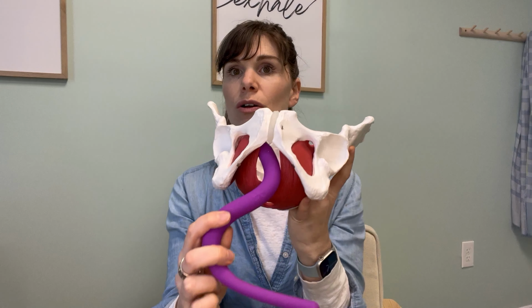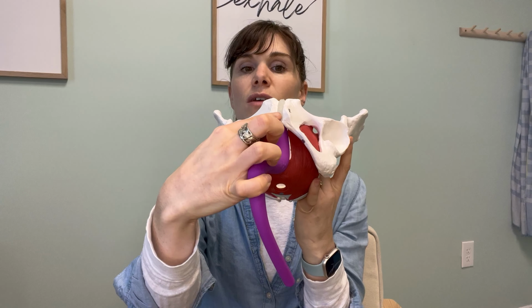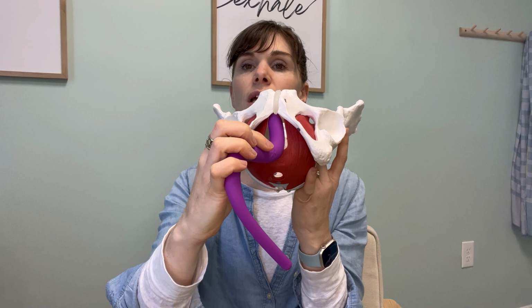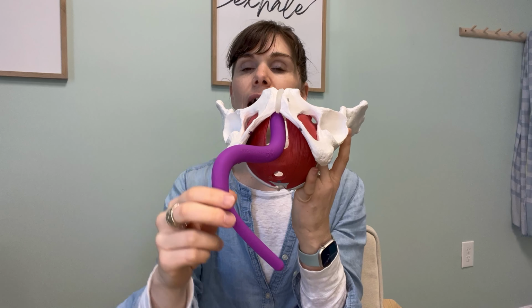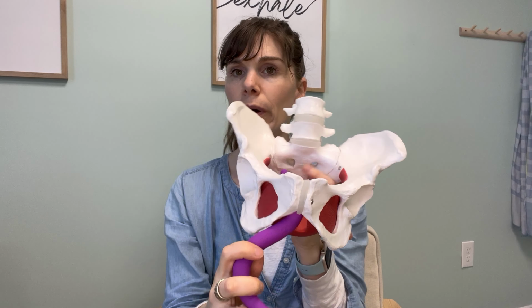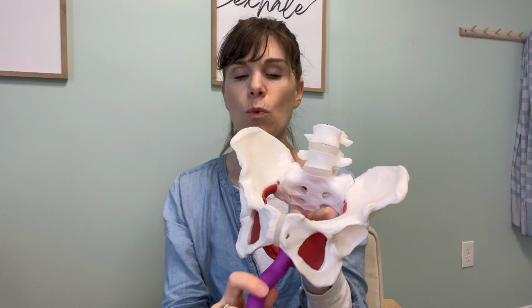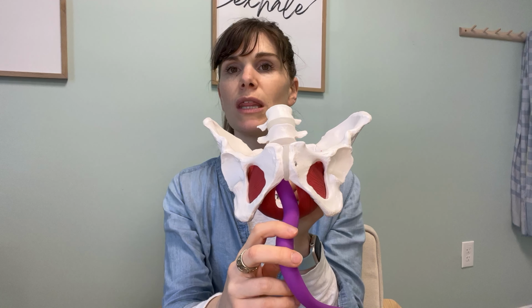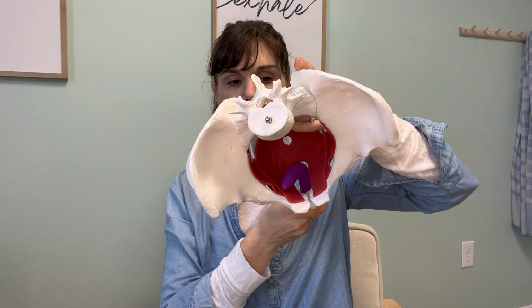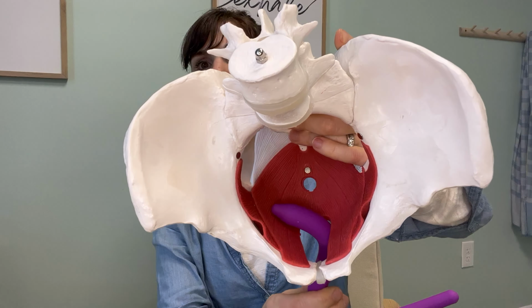Then what you are going to do is bring it to 1 o'clock. So if we picture that our pelvic floor is like a clock, 12 o'clock is up towards the pubic bone, 6 o'clock is back towards the tailbone, and then we have 3 and 9 o'clock out towards the hips. It doesn't matter if you start at 11 or 1 o'clock, or if your clock is facing the other way, but we're really thinking that we want to start off by gently pressing in a clockwise fashion, going all the way around.